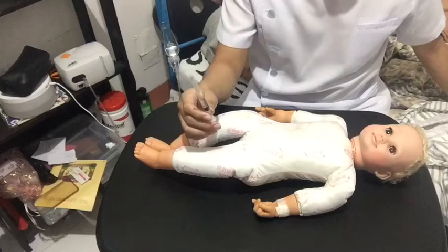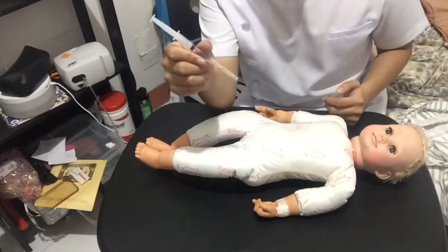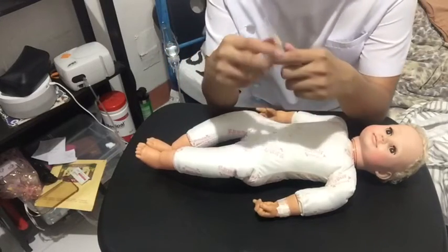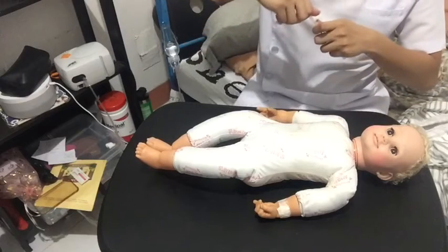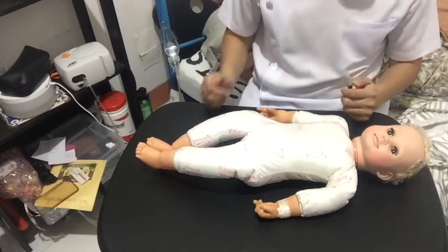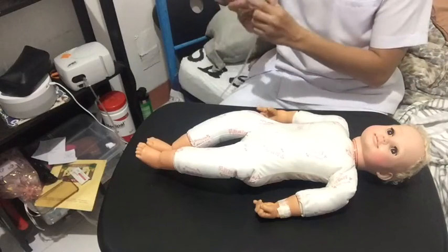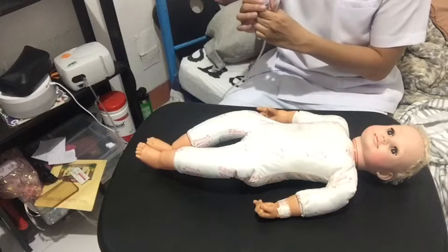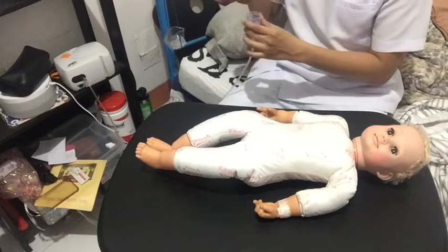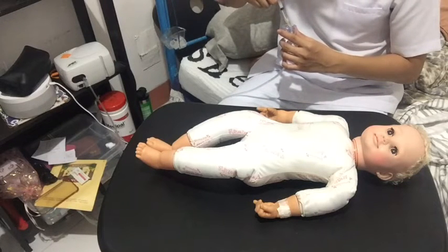Since I do not have a medication, I got this solution from the clinic. So what we're going to be doing is administering the solution into the nebulizer as prescribed by the doctor.